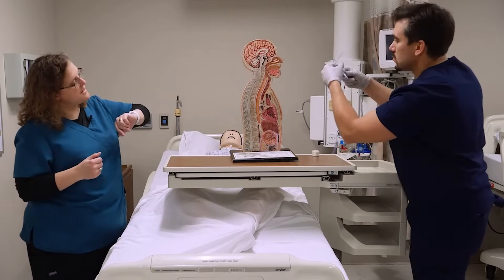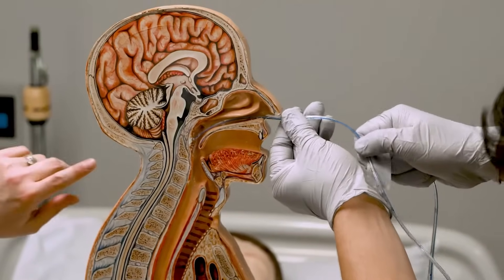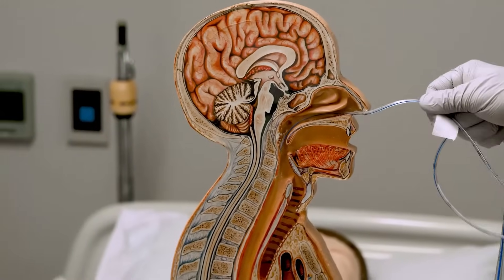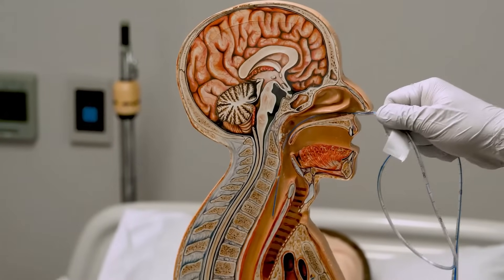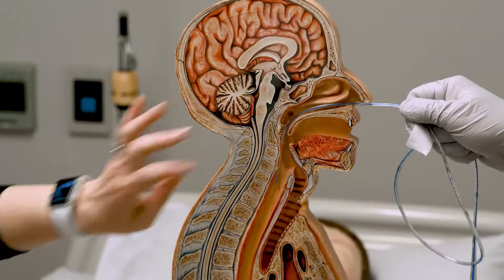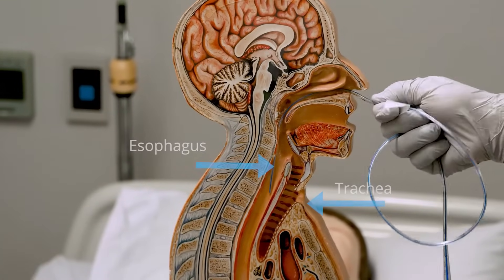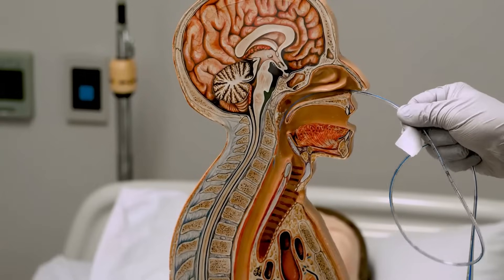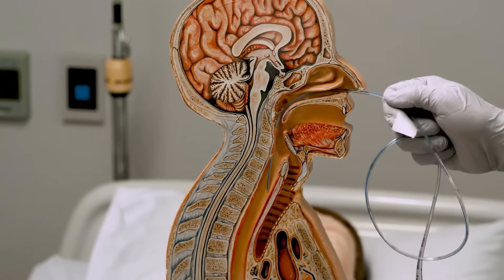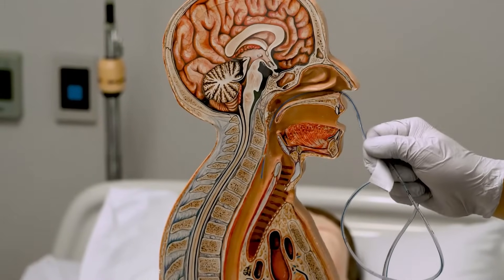He's going to start by passing it past the nasal turbinates. Now when you get to here is when your patient's going to start to gag. They may even throw up if their stomach is very distended. You'll notice that the structures change, so you might have to reorient your tube in order to get past those structures. If your patient's able to swallow water or ice, this is also when you're going to do that. And if not, you're still going to ask them to try to help passage of the tube by swallowing.